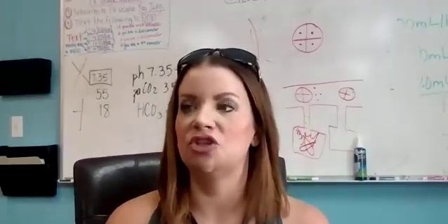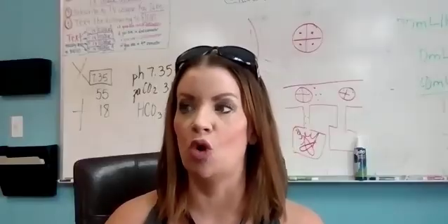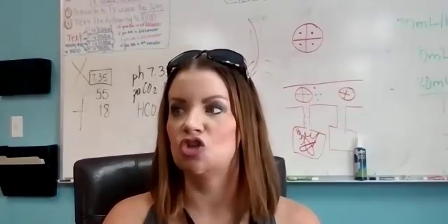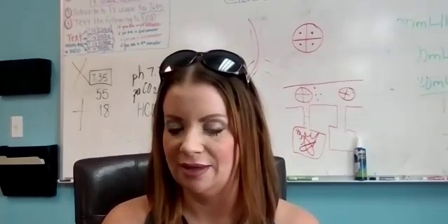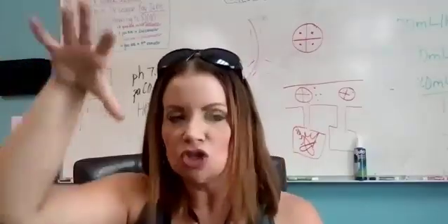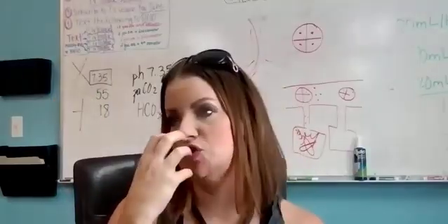So these are for patients who need more volume of oxygen. There's either pressure support or volume support. These patients need volume because we're giving them up to 40 liters. That's a lot of volume. It's what we call a high velocity flow. It is thermally controlled, so it has its own heating system. You have a water bag that you will hang. Don't get this mixed up with your IV fluids. You're going to kill a man. We don't give straight water. Y'all know that. So there's a water bag that is going to drip into the Vapotherm device. It creates humidified O2, and that's what gets delivered to your patient.